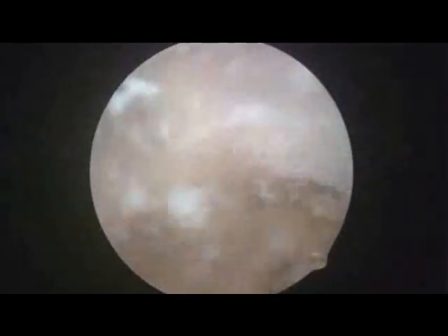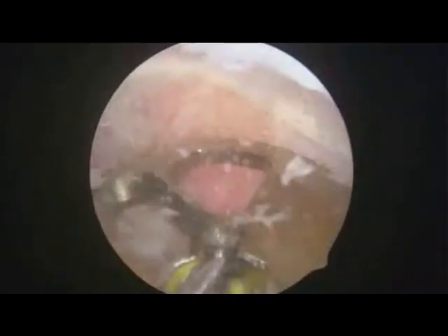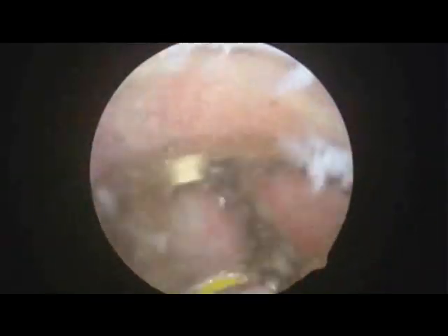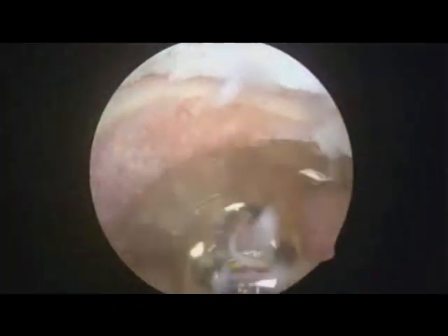What I like to do is just go back and forth, and this will cut right to the bottom of the screw. And I'll show you in there. You see, I get right to the screw, and now it's cut. So there, our slot for our tibial implant is cut. And you can see it's a nice round circle. It's oblique, obviously, because we're coming up at an oblique angle.